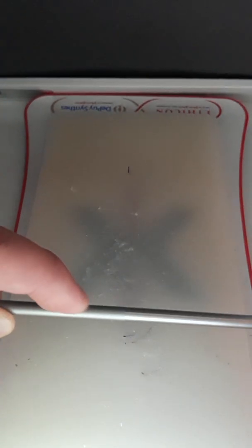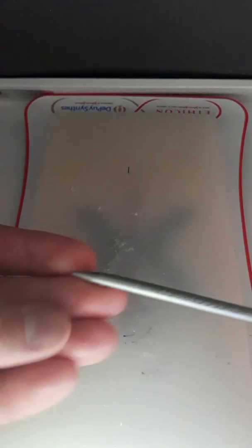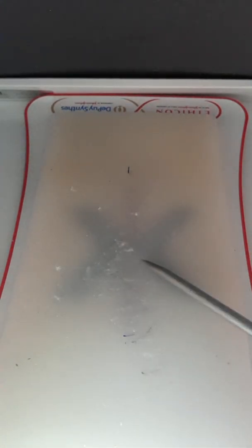There's a difference in the color of the titanium, and all the way up to here you can see the beginning of the handle. Those are two different places where you can decide how long to trim your suture for intercorporeal.